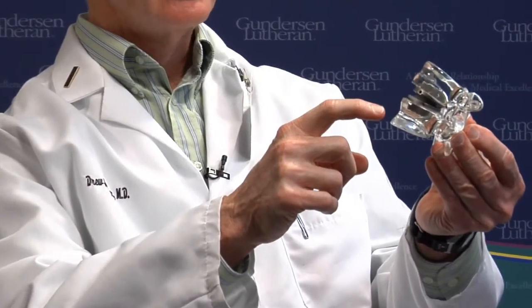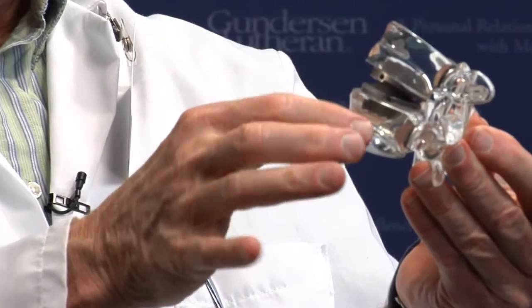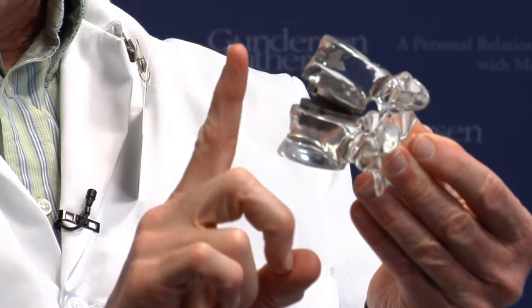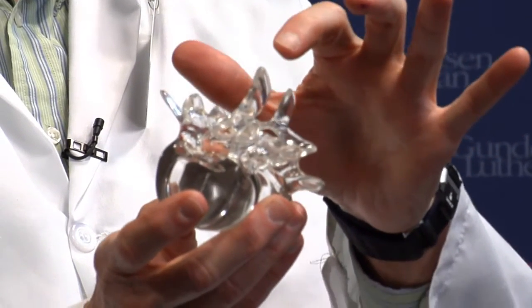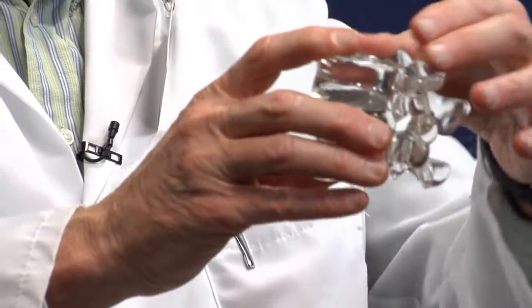This is a model of the lumbar disc arthroplasty device that we use at Gundersen Lutheran. The clear plastic pieces above and below represent the vertebrae below and the vertebrae above. This is the front and this is the back. These are the little bumps that you feel on your back, or that you can see in the middle of somebody's back when you look at them from behind.